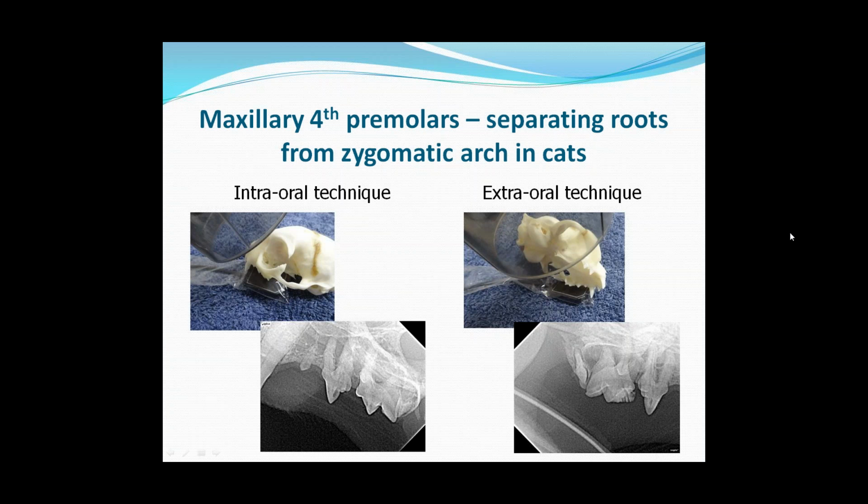Now we have a question. The first question is from Helen: how many radiographs do you need to do a full mouth in cats, and how do I charge for them?